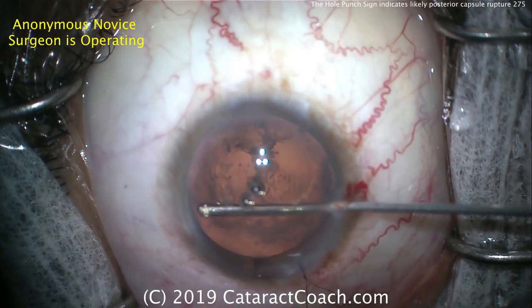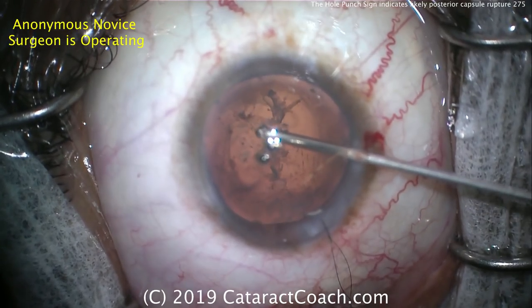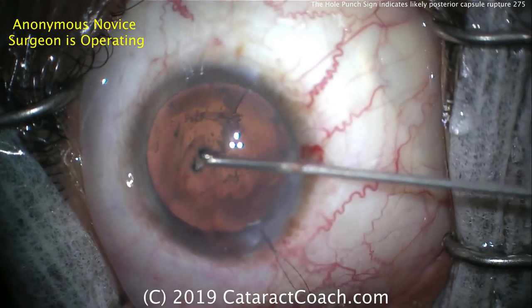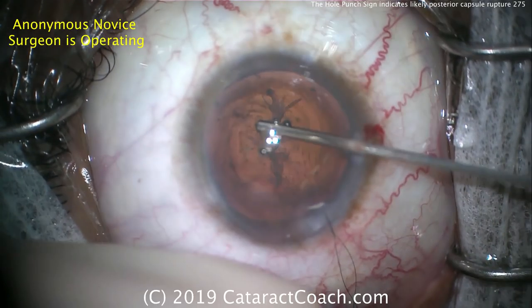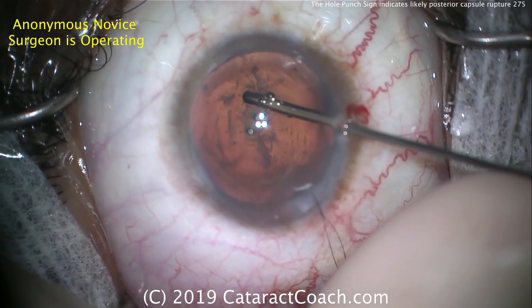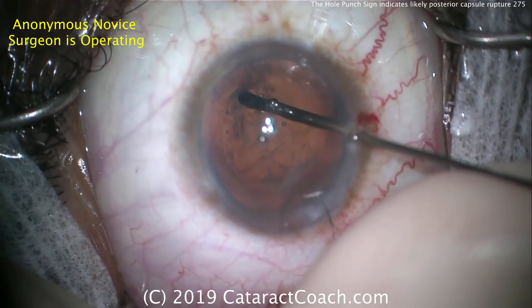The original video was more than one hour — I edited it down to just the best salient teaching points. This surgeon indicated when the video was submitted that he has done only about 20 cataracts to date, and this was done with a more senior doctor assisting him. So with that in mind, this is a very nice result.